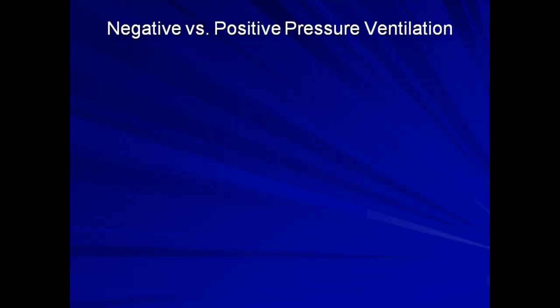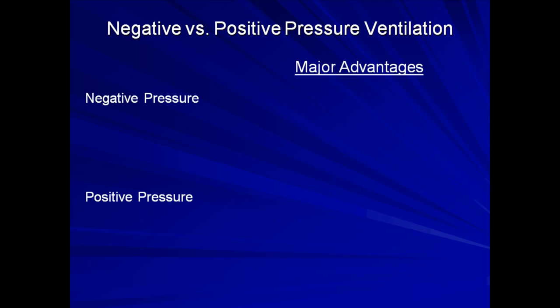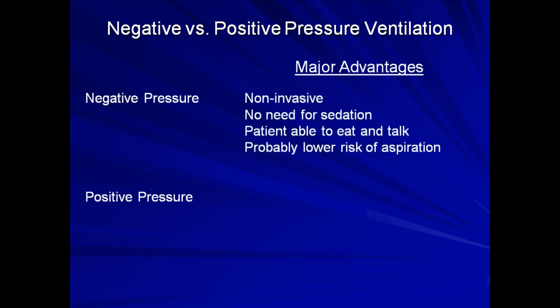Now that we've reviewed a little of the physiologic differences between negative and positive pressure ventilation, what are some of the practical differences? Let's take a look at the major advantages of each. Negative pressure ventilation is non-invasive, does not require sedation, allows the patient to still eat and talk relatively normally, and it is probably associated with a lower risk of aspiration.